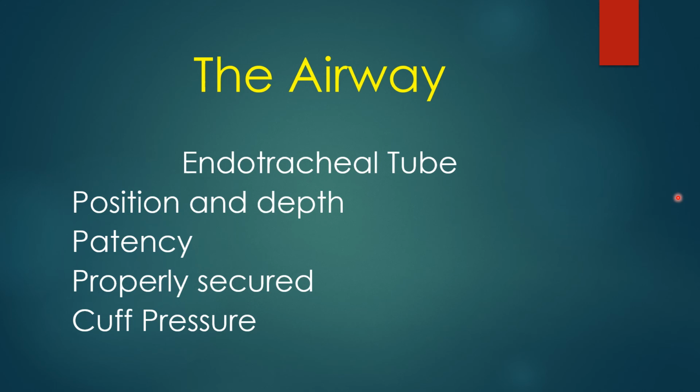Now, it could be a lot of things, and to help figure that out, you can just pay attention to where the tip of the catheter is. As you start to go down the tube, if you feel that obstruction almost right away, that could be that the patient is biting on the tube, and that's not an uncommon problem. Now, it could also be that the patient is not biting on the tube, but he was biting on the tube earlier and left that indentation in the tube, and then the catheter won't pass through there very easily.